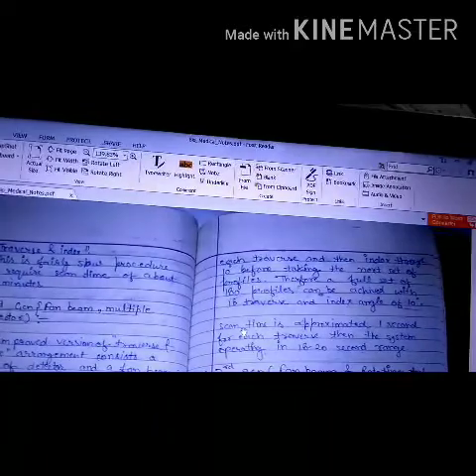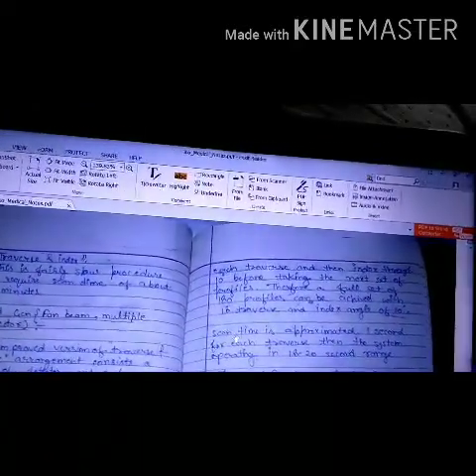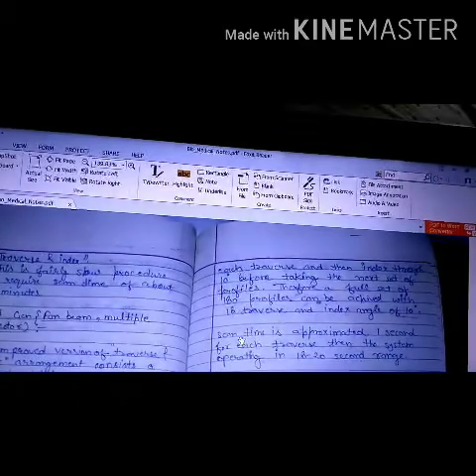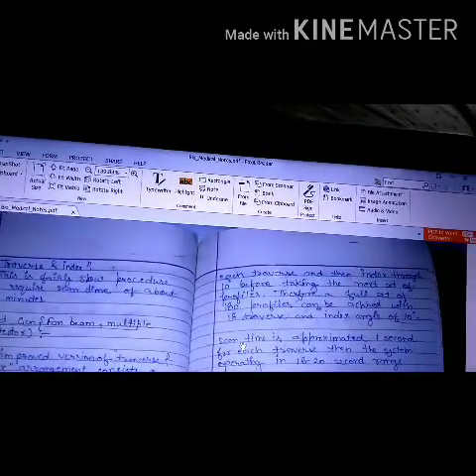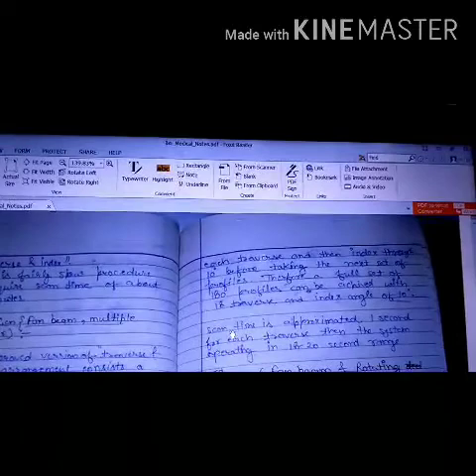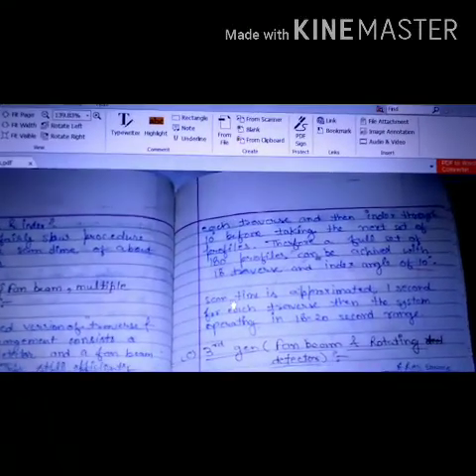Okay, then we move by 10 degrees, and again in a different direction those 10 arrays record the data. In this way, what was done for a particular 1 degree at a particular time was completed in the same time, and we were able to scan 10 degrees. So this was a very great advantage over the previous technology, as it saved a lot of time.